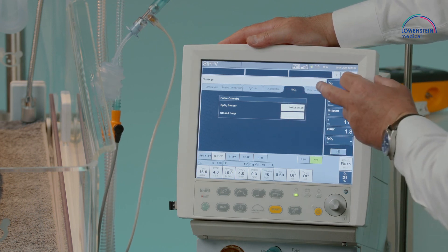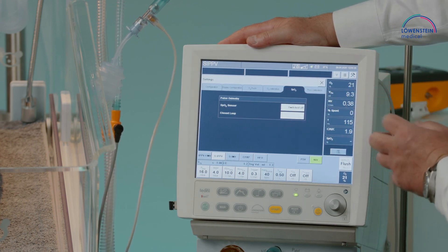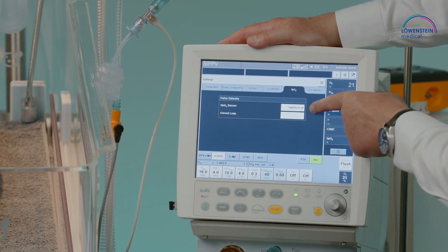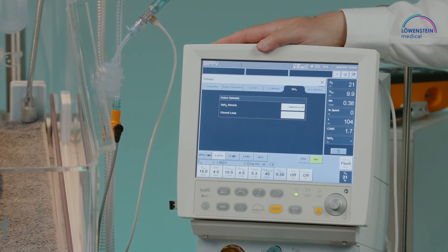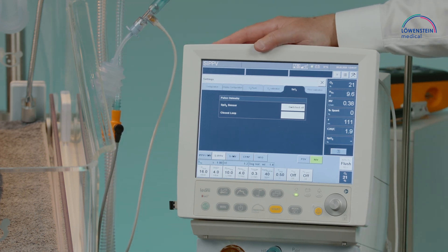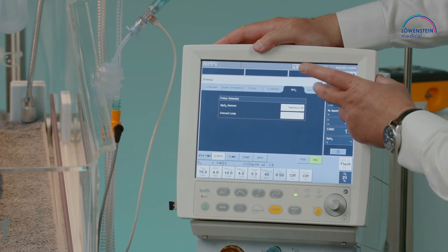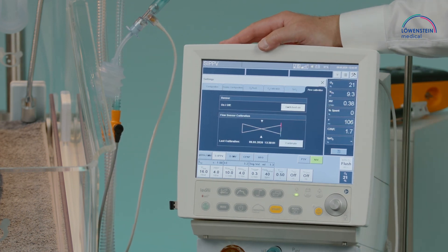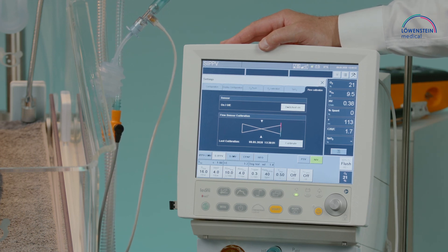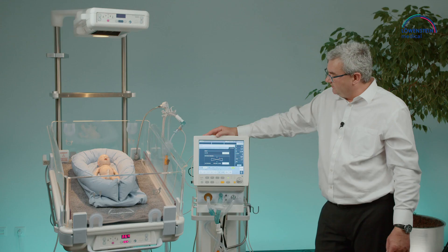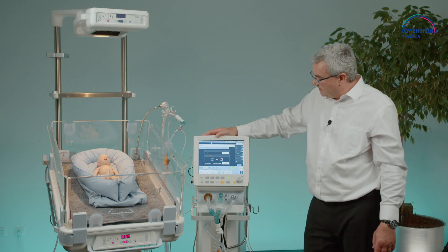We already have SpO2 for Masimo. We can also switch on the SpO2 function to measure the patient's saturation from the Leoni Plus. Flow calibration is also available, allowing a calibration to be run during the working process on the patient.